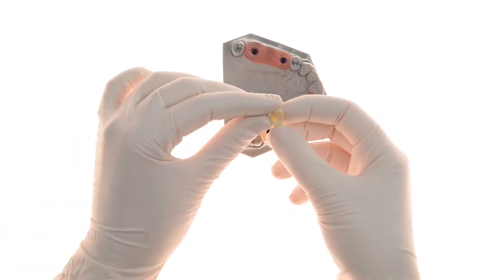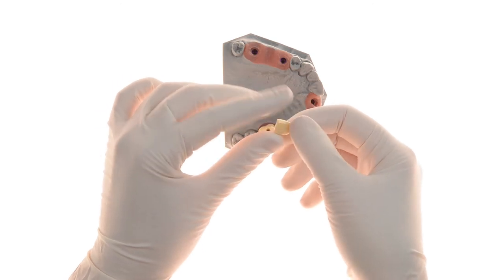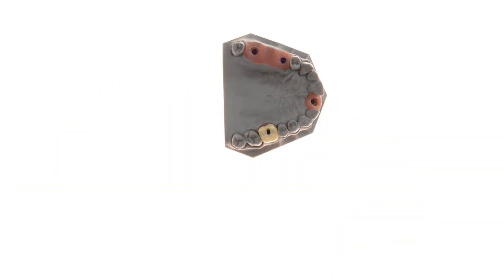Following the scanning, a custom-made restoration may be designed and milled, which includes the planned opening for the screw channel.